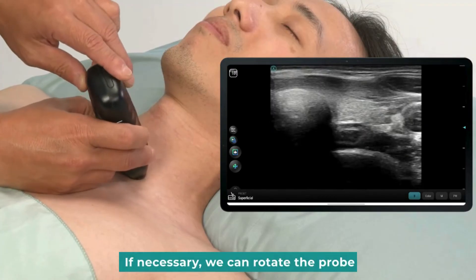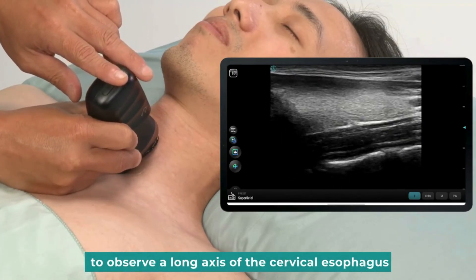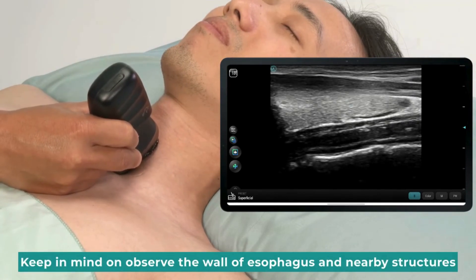If necessary, we can rotate the probe to observe the long axis of the cervical esophagus. Keep in mind to observe the wall of the esophagus and nearby structures.